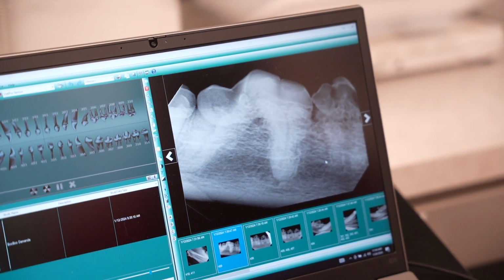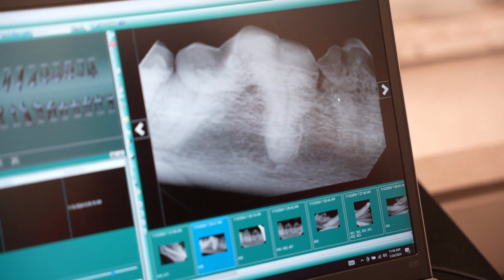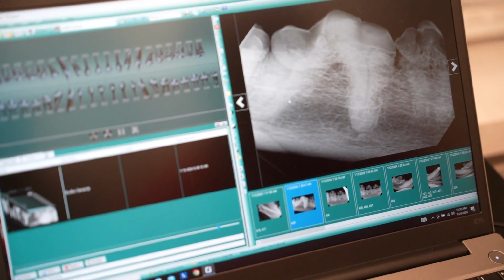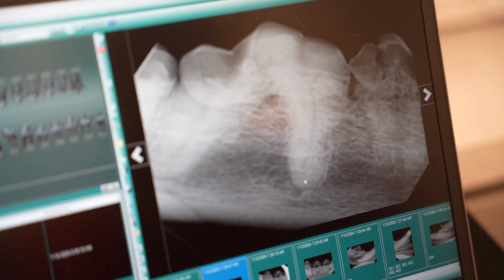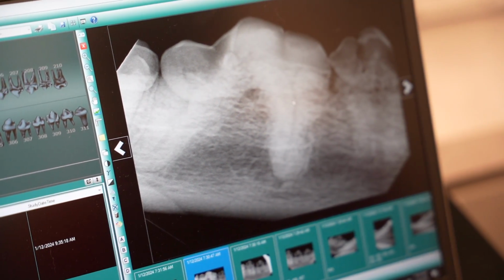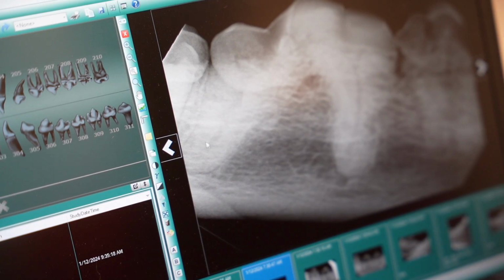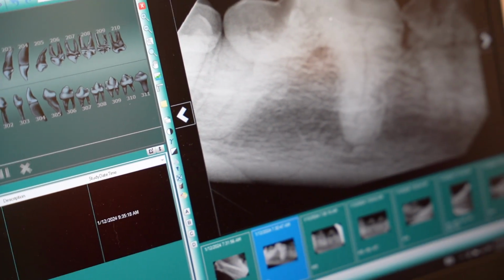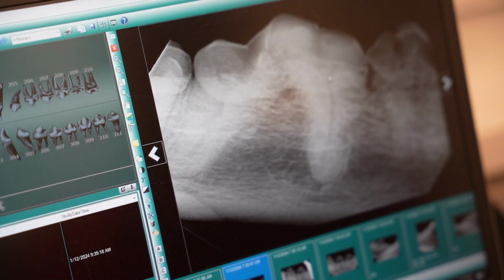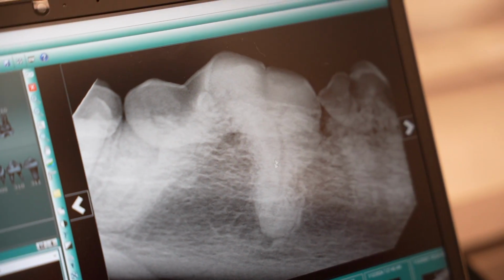That thing was worn down a little bit. So this dog was, I think, 13. It was a big shepherd mix. This is the crown of the tooth that we're paying attention to. These tracks going down, sometimes easier to see than others, is the pulp. Whenever you are getting a root canal in a dog, cat, or person, you are essentially killing all the nerve endings in this canal.